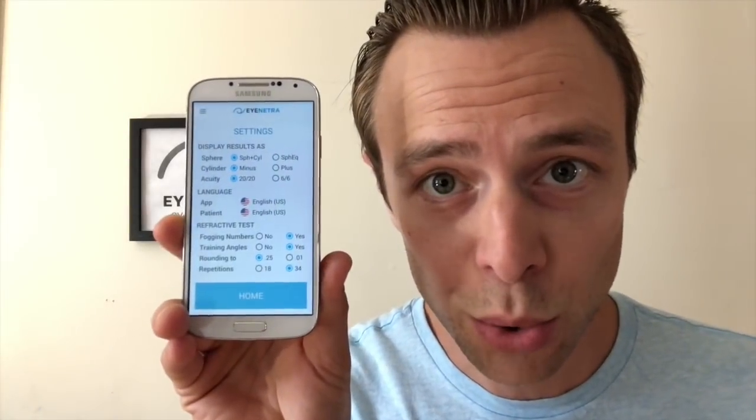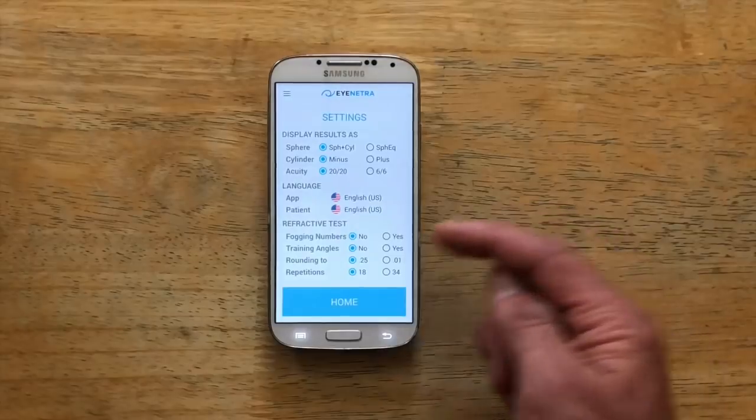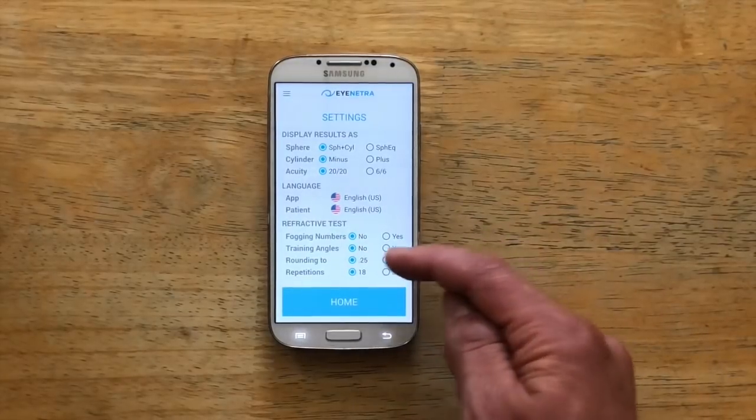Rounding: this feature allows you to change how your autorefractor results are displayed. Netra rounds to the nearest quarter diopter (0.25D), however you can disable this by selecting 0.01. This can be great if you want a higher level of precision to do the rounding yourself, if you're trying to diagnose very small levels of astigmatism under half a diopter, or if you're running a side-by-side experiment with the device.